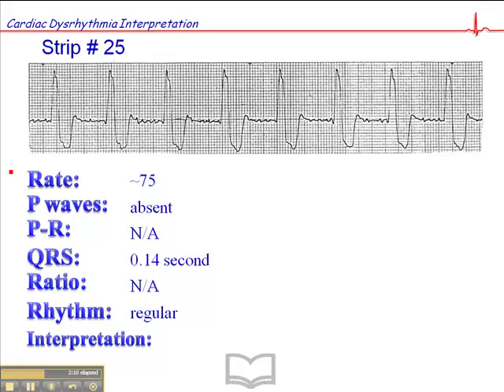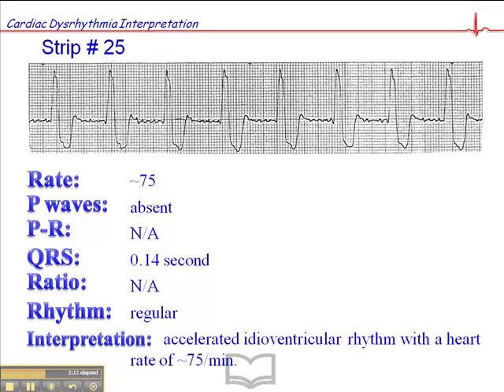So it's not atrial flutter, it's not atrial fibrillation, it's not a junctional rhythm. The interpretation of this rhythm is an idioventricular rhythm. And because the heart rate is 75, which is above what you would expect — the inherent rate is 20 to 40 — we call this an accelerated idioventricular rhythm.